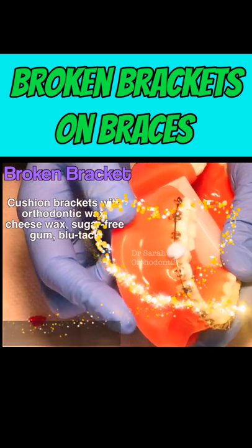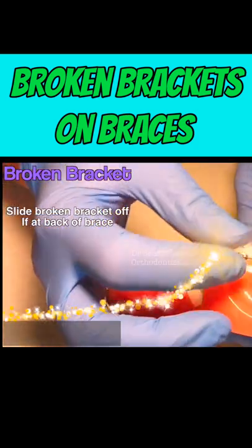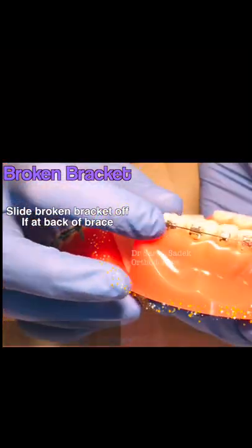If the bracket that is broken is at the back of your brace, you may be able to slide this bracket off the brace with your fingers.